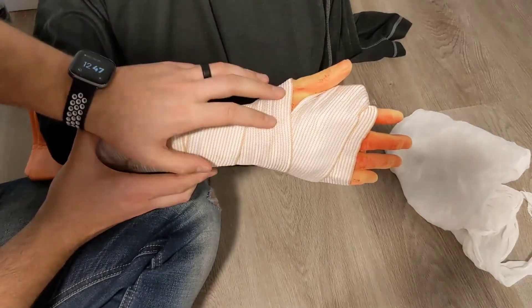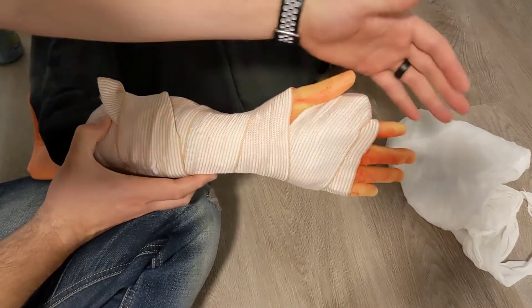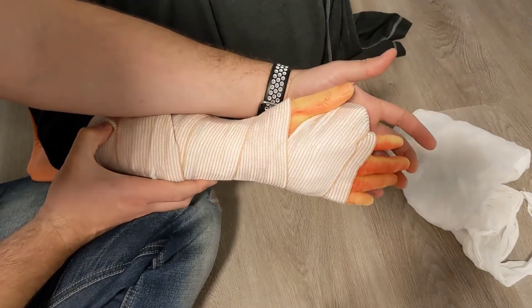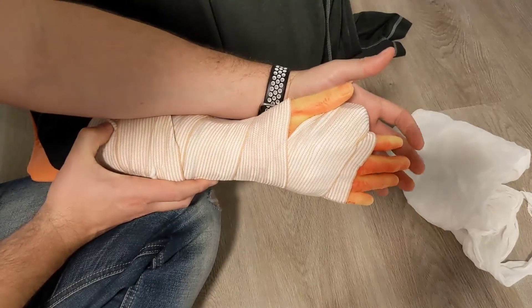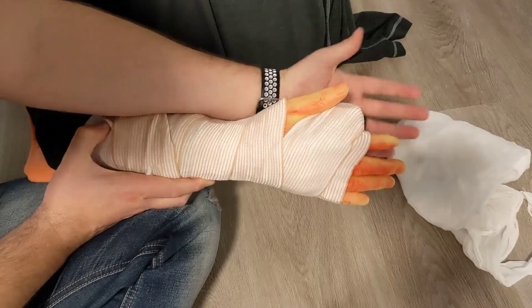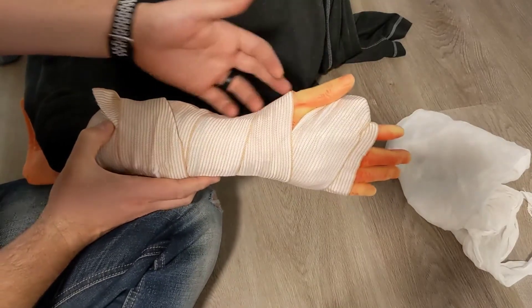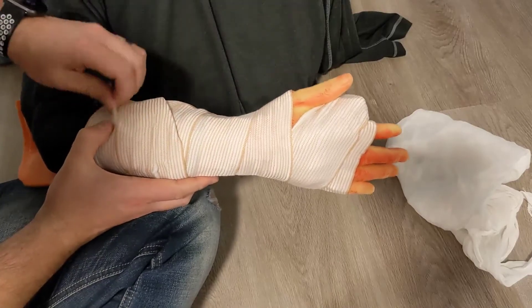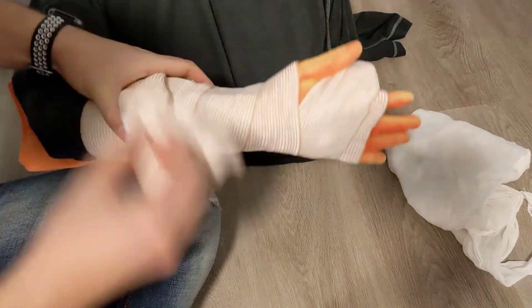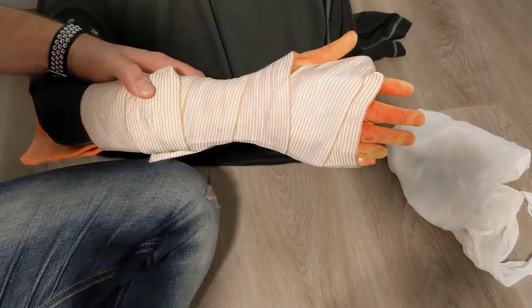That's the immobilization of the wrist injury. Once the splint is on, we want to recheck CSM — check for good color and warmth, that they can feel what we're touching with no numbness or tingling, and that they have movement in their fingertips. This tells us we didn't cause further injury with the splint, and now we can transport while monitoring CSM. The splint is fully adjustable — if the patient says it's getting too tight, simply untuck the elastic wrap and rewrap it a little looser.